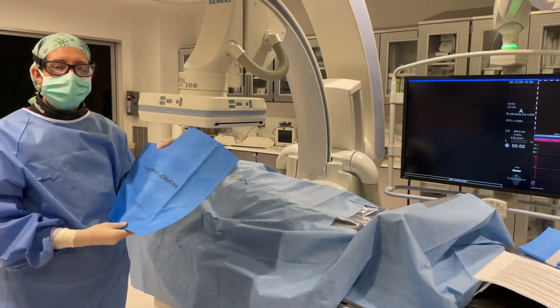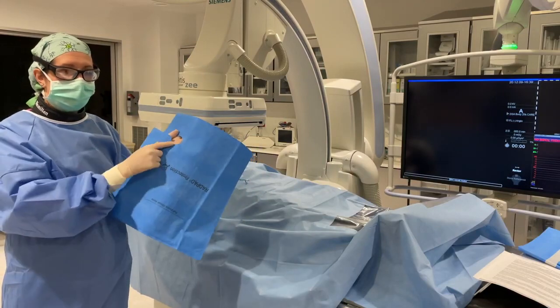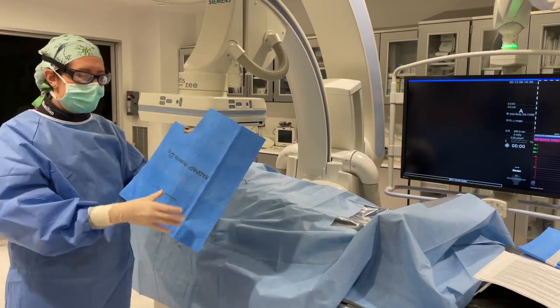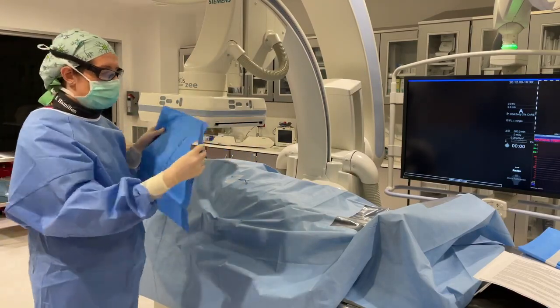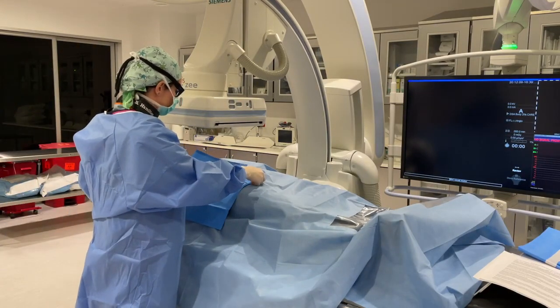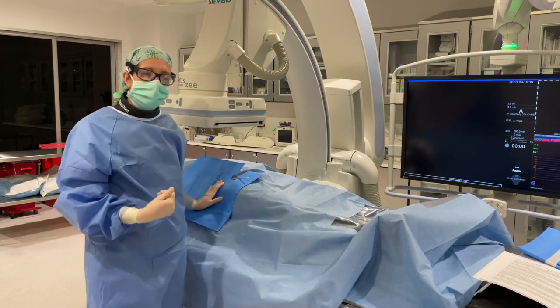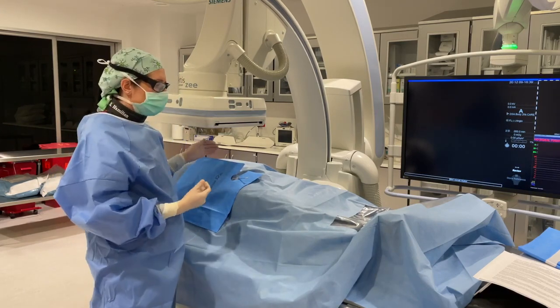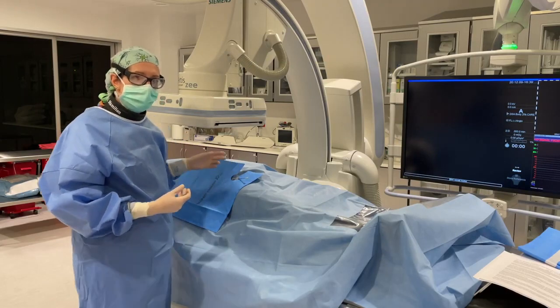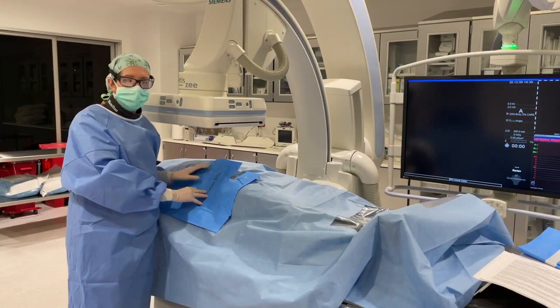For fluoroscopically guided cases using the femoral access, you can use this femoral access drape with a little hole, and you place the fenestration around the sheath once you've placed it. And this provides scatter protection from the abdomen. And if you're working in the lower abdomen or the pelvis, you can fold the drape over so that it's not encroaching in the image field of view.